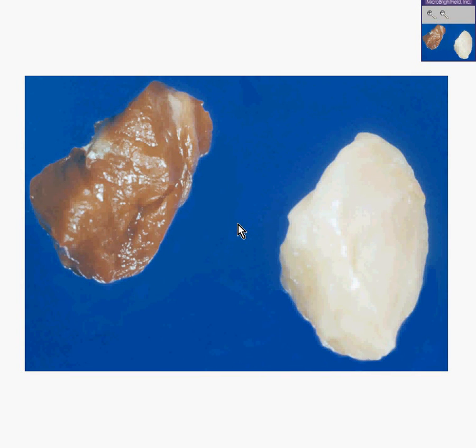Here is another case of muscular dystrophy. In the earlier stages, the normal brownish, beefy, or meaty appearance of the skeletal muscle may look a little bit lighter or grayer than usual, in some areas more than others. And in a severe example or advanced form of the disease, it's basically all fibrous tissue. And if you wanted to find muscle fibers in there, you may have to look with a microscope and look very hard. So let's look very hard with the microscope.